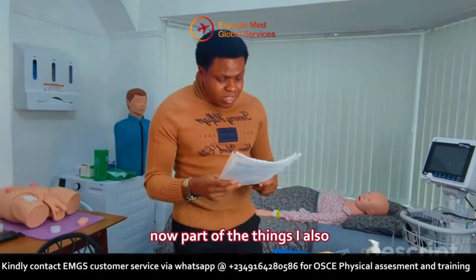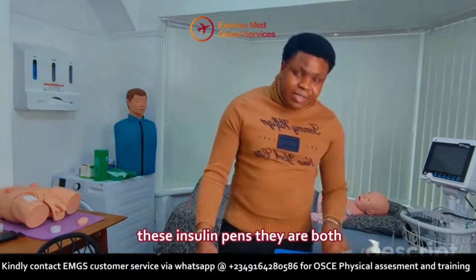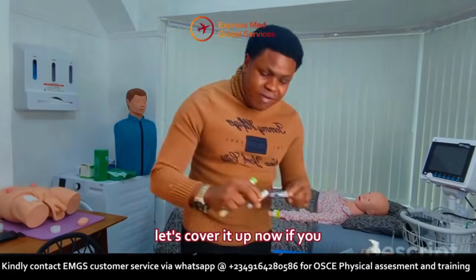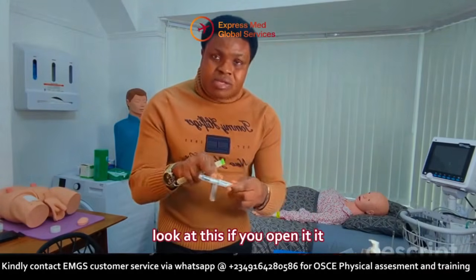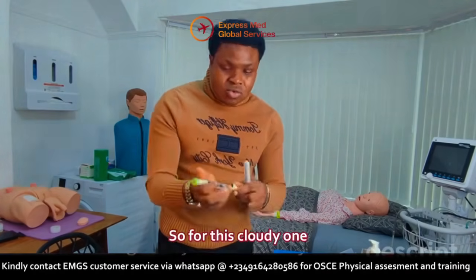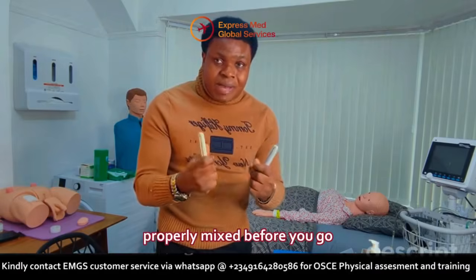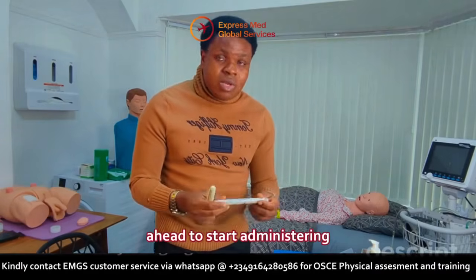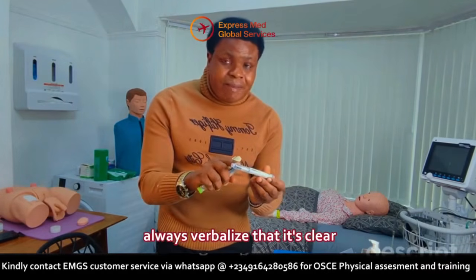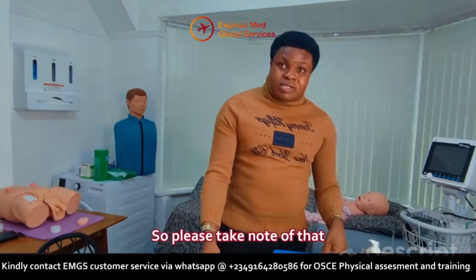Now, part of the things I also documented was the different insulin pens. If you look at these insulin pens, they are both different. If you look at this, let's cover it up now. If you open it, it will be very clear. But for this, you see, it's a bit cloudy. So for this cloudy one, you may need to roll it with your hand just to ensure that it's properly mixed before you go ahead to start administering. So always take note of that. But for this that is clear, always verbalize that it's clear, there's no precipitate, and you are happy to use that. So please take note of that.